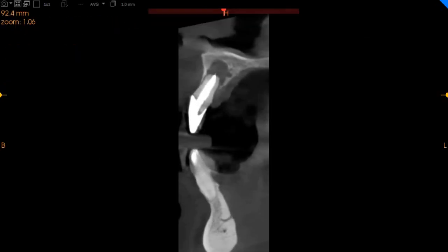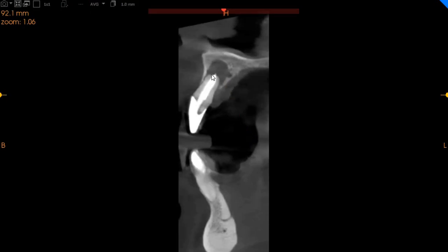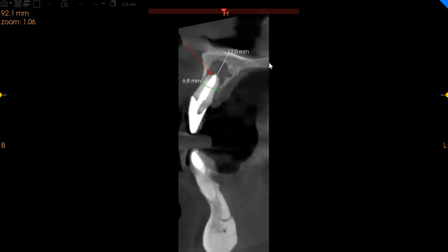The central incisor has a periapical radiolucency and has resorption around the roots, which you can see right here. This tooth is definitely not doing well health-wise. We've got 6mm of ridge width with 12mm of height. An immediate implant placement will not be possible, but a delayed one will be.